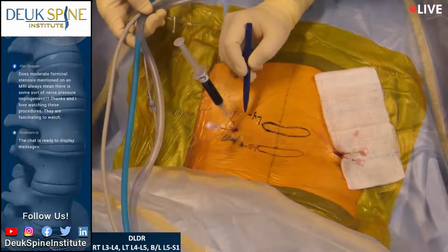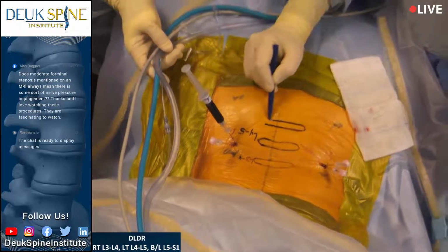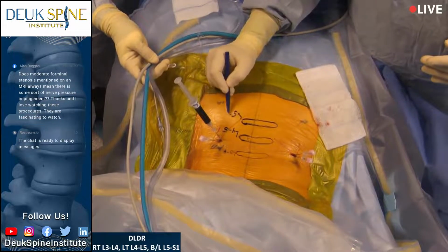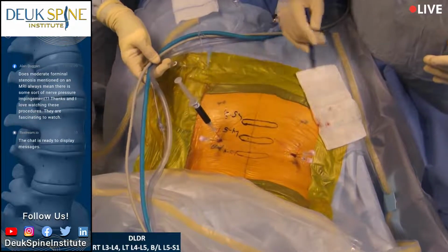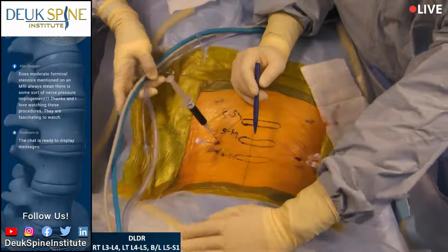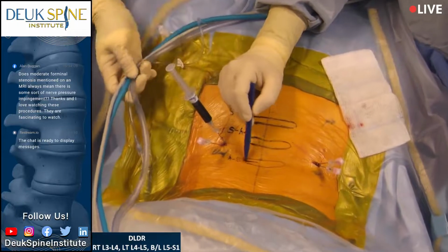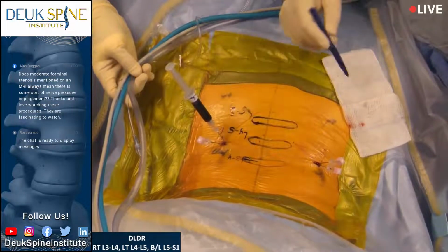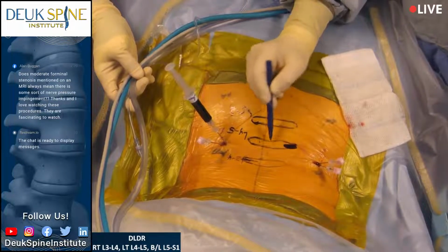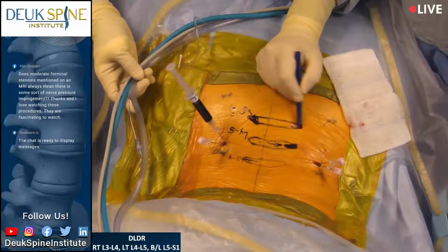So we are fixing 3 discs today. She has degenerative herniated discs at L3-4, L4-5, L5-S1. And that's what I've done here, I have drawn the discs on her skin for you so you can get an idea of what's going on inside. Now on the L3-4, can you guys see this all right? There's a tear on this right side and the jelly has pushed through the tear. I think that disc is very painful. And then at L4-5 on the left, she has a tear and the jelly from the center has pushed out through that tear. At L5-S1, she's got a slip and she's got herniations on both sides.